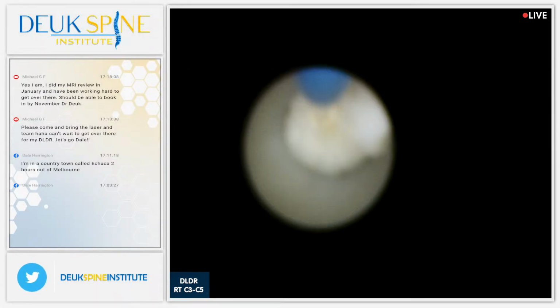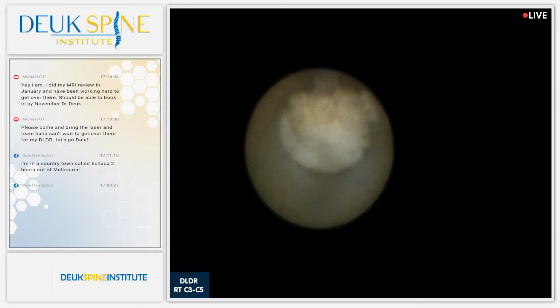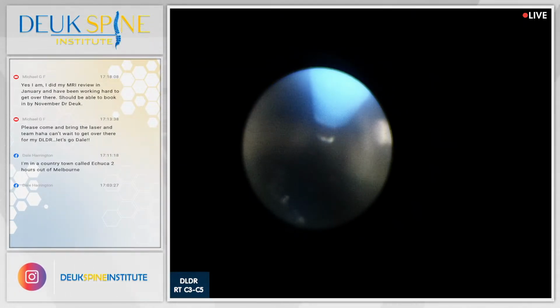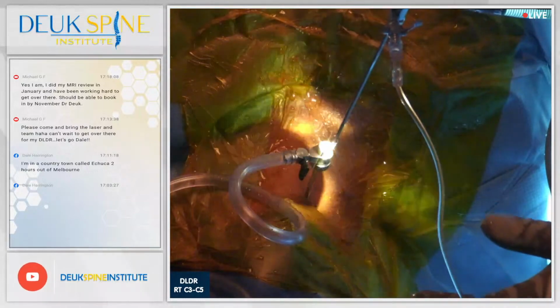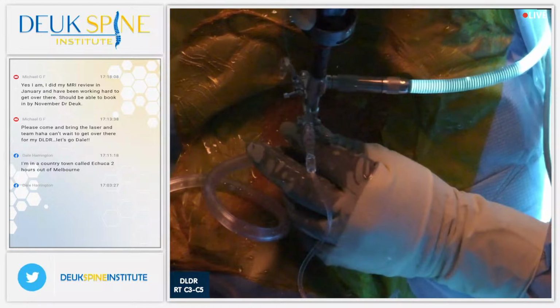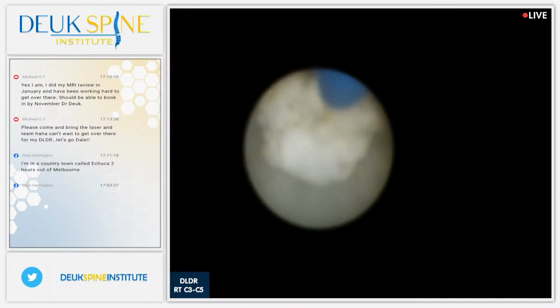Right? That looks like an apple core, yeah. That piece of herniation, it sure does. I'm gonna grab that out. I don't think I'm gonna get it. It's all scar tissue from inflammation from the herniation. It's really thick. I'm just gonna have to laser it. All right. Look at that, calcium. Nasty.